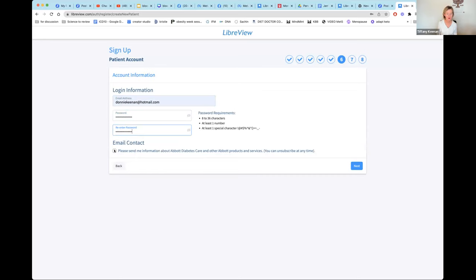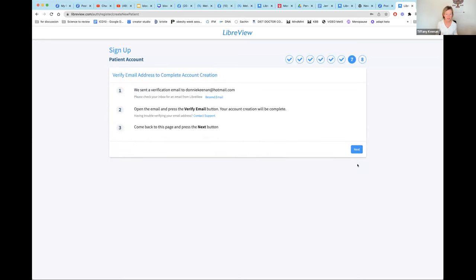You can opt in for more information from Abbott. I was able to set up an account, but it says to verify the email address to complete account creation. Once you hit Next, you'll get a link in your email — open it, press the Verify button, and then come back to this page and hit Next.